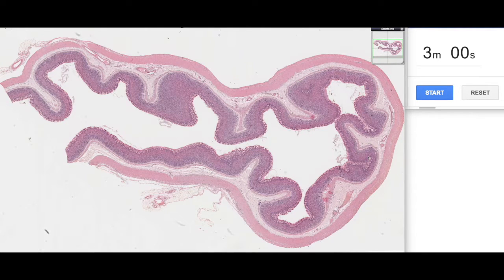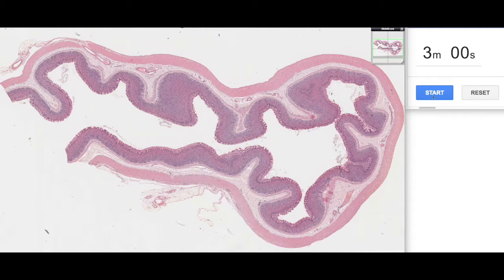Hi and welcome to this next episode of 3 Minute Histology with Jamie Chapman. Today we're going to be looking at a histological section of the body of the stomach which you can see here. So let's begin our three minutes.